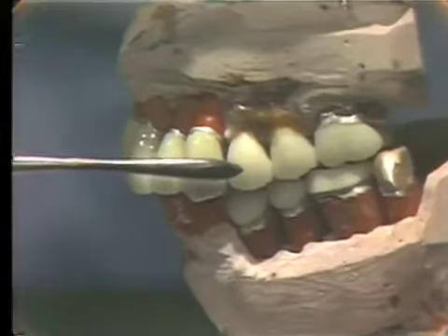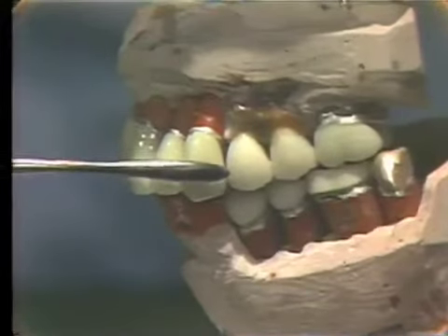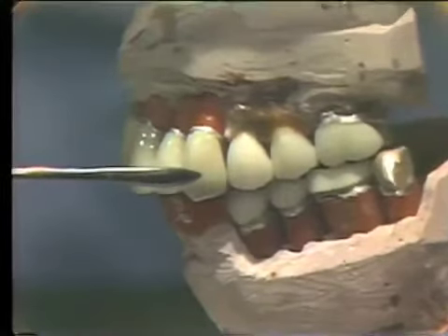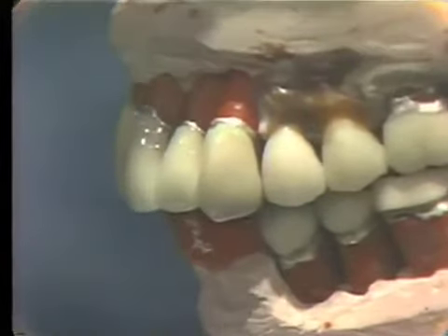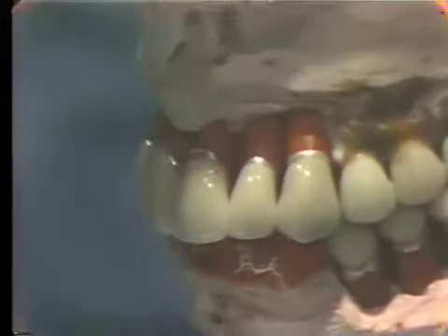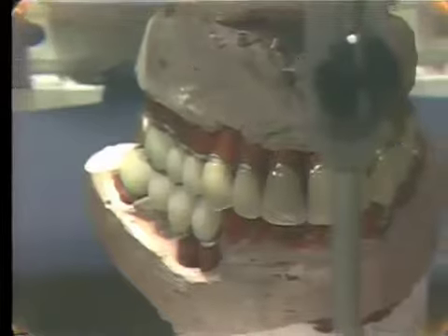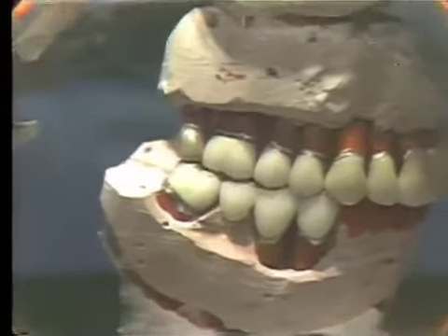If you are going to solder after the porcelain is baked, you have to wait till after we get the glaze on these before we can do the soldering. The anterior teeth we contoured the last time, and they have been glazed, so now we can go in and check in the mouth our final aesthetics. If we wanted to do any staining or characterization of these anterior teeth, we would do it at this time. But the anterior teeth we contoured last time for the feminine characteristics, and now they have been glazed.